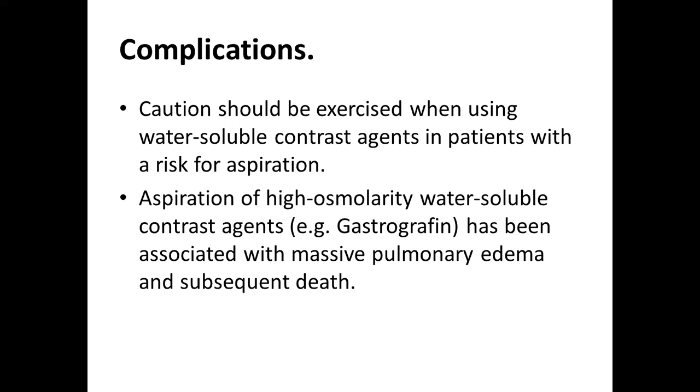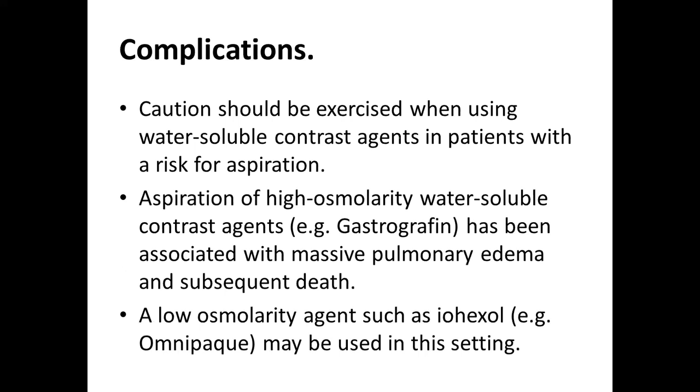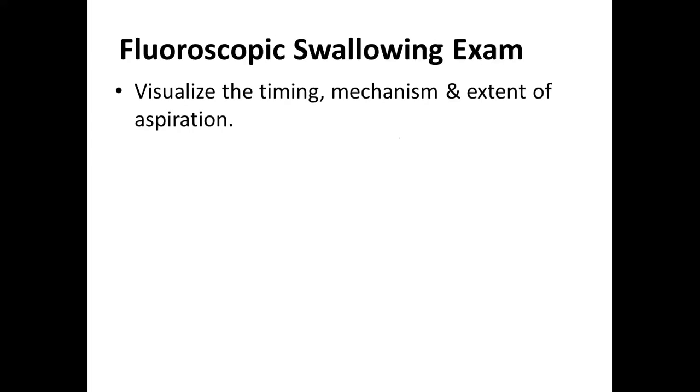Aspiration of high osmolarity water-soluble contrast like Gastrografin is associated with pulmonary edema and subsequent death. An oral low-osmolarity agent like iohexol is very good in this setting because of its little effect after aspiration. The aim of the fluoroscopic swallowing examination is to look at the timing of swallowing, the mechanism of swallowing, and the extent of aspiration, if at all we have one.